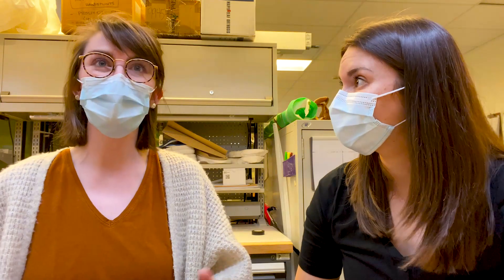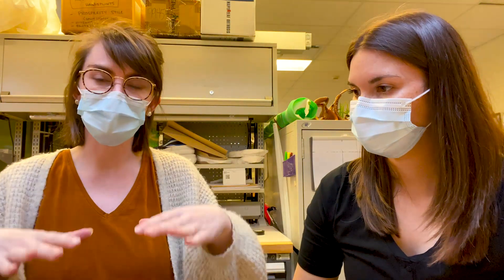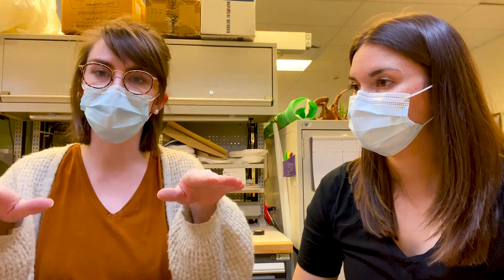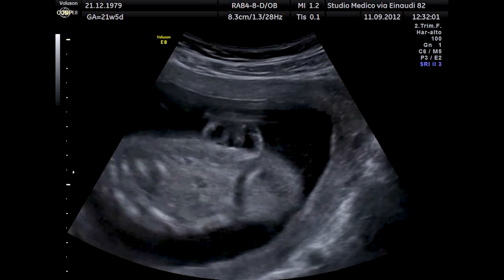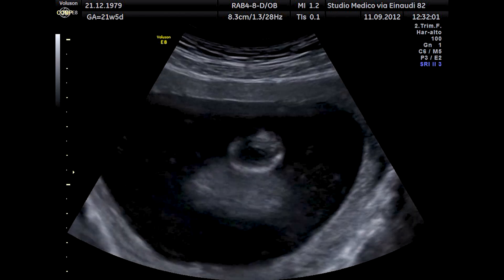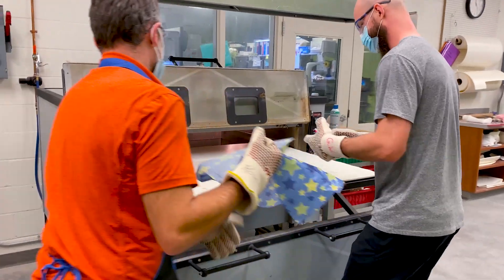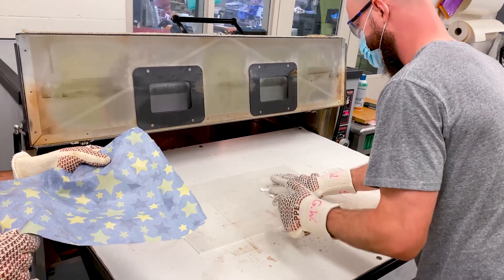Someone needs an HKAFO when they have weakness around the ankles and also around the hips, causing their feet to turn inwards. Having joints that are attached can help to externally rotate them so they're less likely to trip. This patient was born with spina bifida — a condition that occurs early in pregnancy when the backbone doesn't form properly, often resulting in damage to the spinal cord and nerves. This boy has been wearing leg braces for years but has grown out of his last pair, so the team is making a replacement.